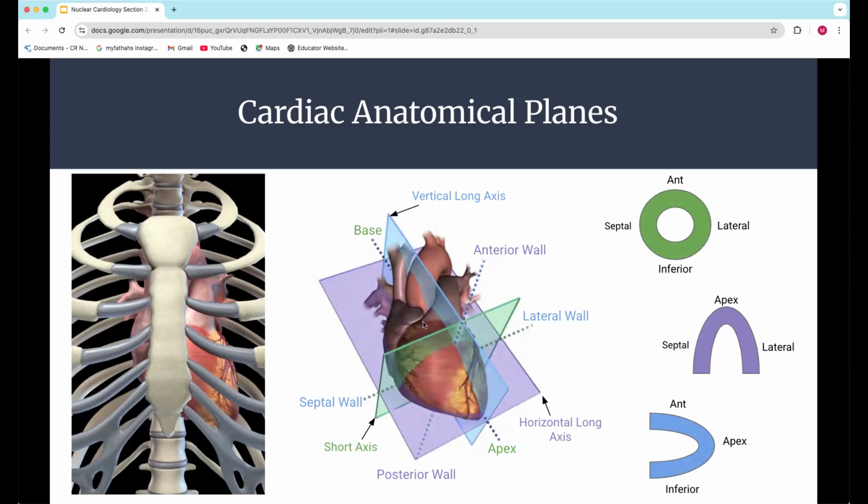So if you do that for a ventricle, your ventricle's like a cup, you're going to end up with something that looks like a donut. If I took my hand like this, and my heart was here like this, and I took it out of the body and then put it like this on the screen and sliced it, that's what you're going to end up with, a bunch of donuts, right?